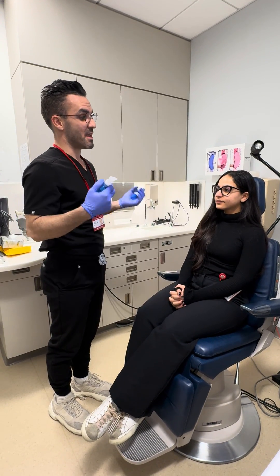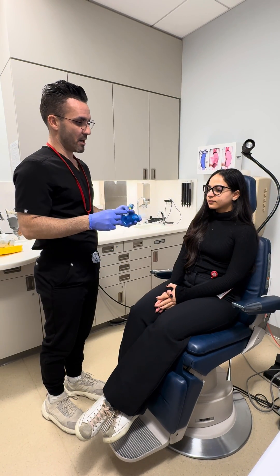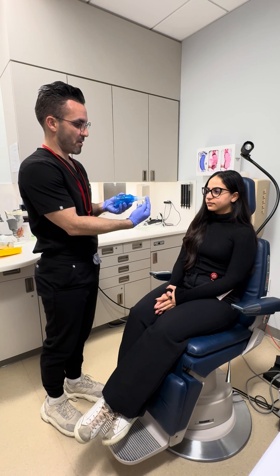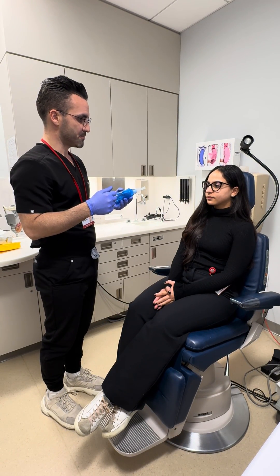Okay, so now we're gonna see how strong your breathing-in muscles are. What I'm gonna have you do is blow out all of your air until you can't breathe out any more. Then you're gonna gently bite on this end, making sure there's no air leakage out of the side. I'll help you out, and you're gonna suck in as hard as you can. We're gonna do that a few different times to see what your maximum is. Sound good?